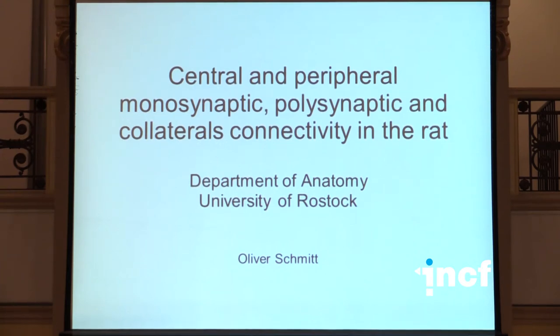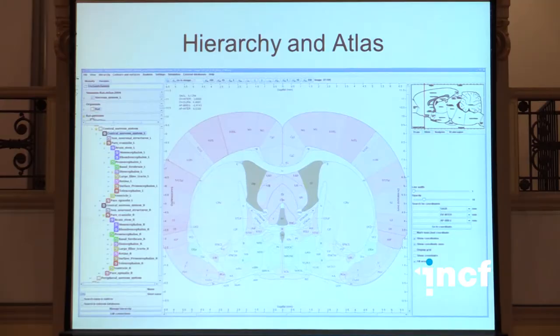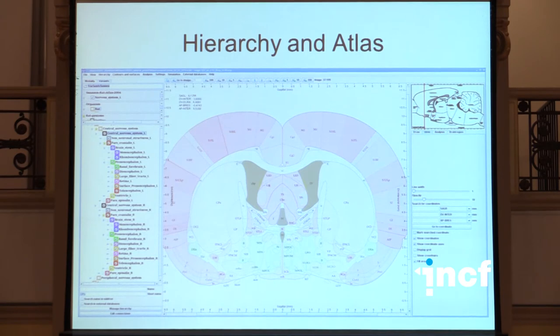Good evening everybody. I will consider the structural rat connectome in a generic and platform independent open framework called NeuroVisas. The system allows you to import different types of image stacks, for example MRI images, histological images, or atlas images, and then outline regions in these images and assign them to a user-defined ontology.